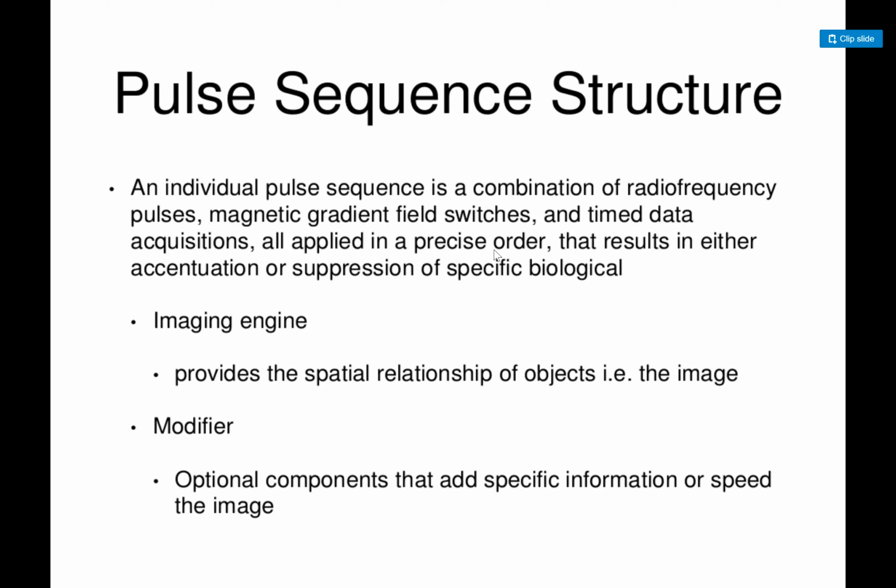So I wanted to go over what is pulse sequence. I just talked to you about the radio frequency pulse that we give, which switches or flips the angle, and is a part of a pulse sequence. You have to apply these sequences in certain form to create an image.